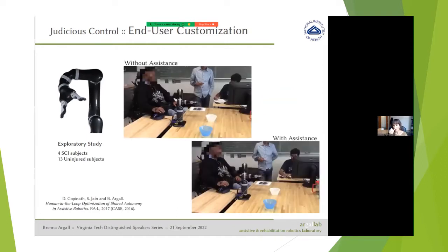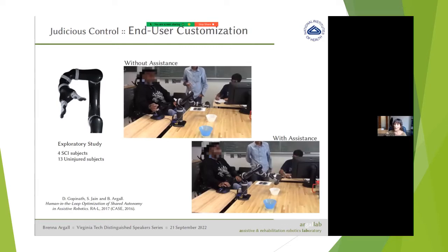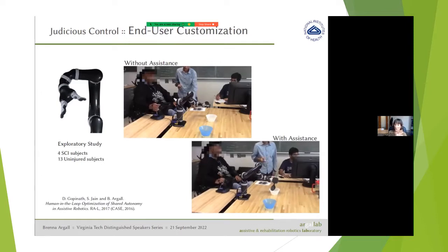And here's a video of what that assistance looked like. You already saw the video on the top. What you can see on the video on the bottom is that the control is happening in all 6 dimensions simultaneously. We're rotating and translating at the same time because the autonomy has stepped in. In the study, the inference is trying to pick which of these 2 goals the human is going towards. And the confidence in the goal prediction is actually what's on the x-axis of that function I just showed you. So you're not going to provide a lot of assistance until you're very confident that you know which goal the human is going for.